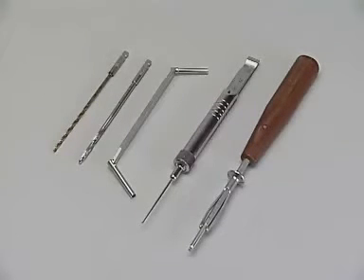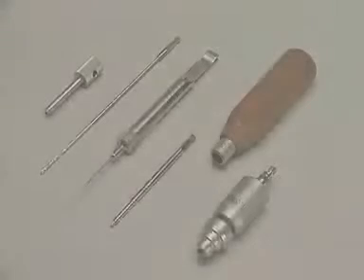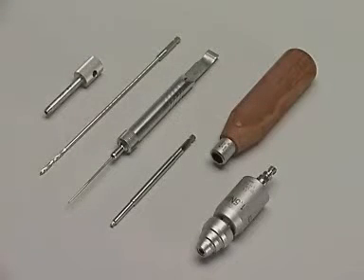Therefore, the 2.5 and 3.5 mm drills, the 3.5/2.5 double drill guide, the depth gauge, and the small hexagonal screwdriver are required. The 3.5 mm locking head screws need the LCP drill guide, the 2.8 mm drill, the depth gauge, the screwdriver shaft, the torque limiter, and the handle.